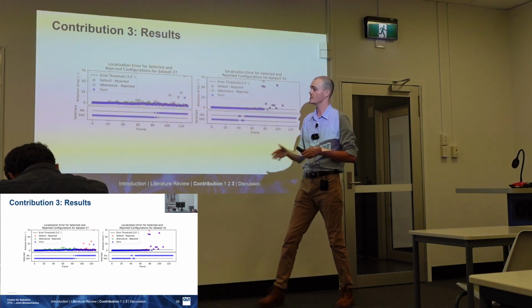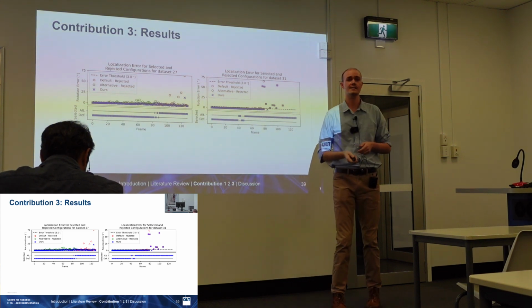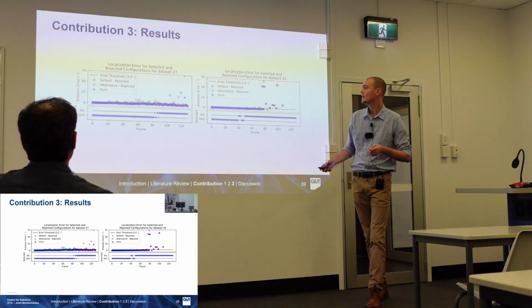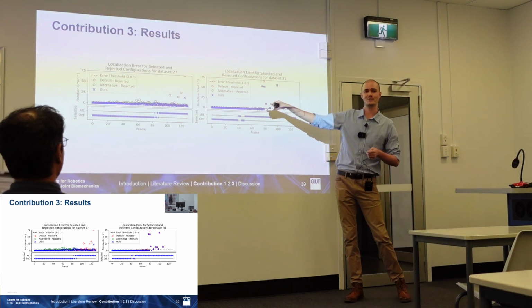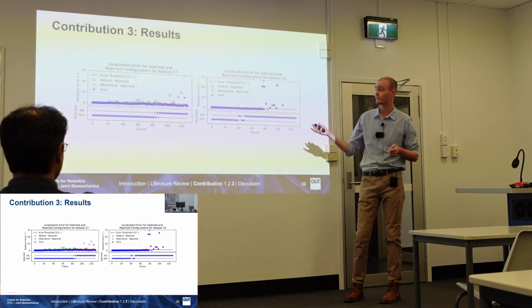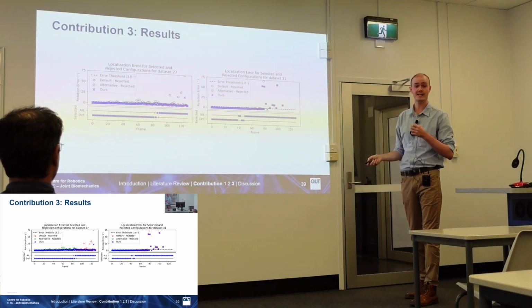Using our approach, though, as you can see here, using the default configuration early and then switching to the alternate configuration, our approach is able to maintain acceptable localization performance throughout the whole trajectory traverse, even though both of the individual systems would have failed. In the right-hand plot, we see the opposite case, where the red circles and the green circles completely overlap. And that means that we've got no good option for our system to pick from, and so it fails as well. And this highlights why it's so important to pick different failure modes in your underlying configurations.